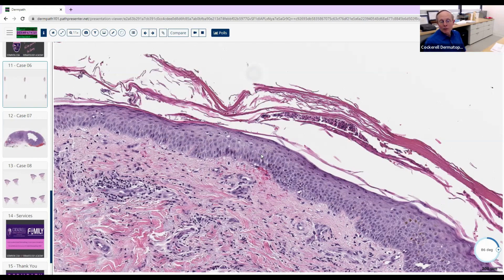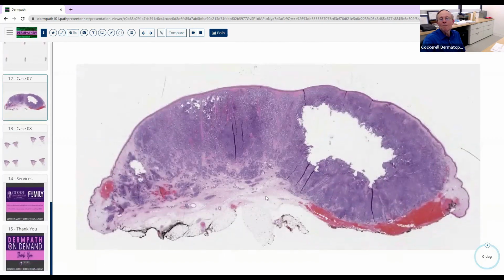And then sometimes we get an unusual dystrophic, dysmorphic tinea infection in immunocompromised patients. I've seen a case a few years ago that actually looked like blastomycosis because the organism actually kind of started growing in the dermis. So there's a lot of different patterns of tinea infection. So just make sure you're well aware of those. So that's good. That's basically what you were supposed to see here.